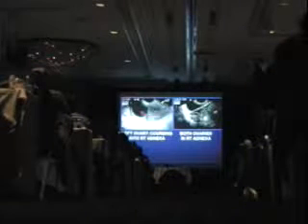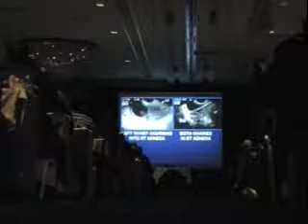Here's two more examples for you. In this case, notice here, the right ovary was off somewhere here. There's a leading edge here. The uterus is here. But this is the left ovary coursing into the right adnexa. And here's another patient, the right ovary and the left ovary. You see where the uterus is. How often have you seen both ovaries to one side of the uterus? This is the time you might see it.